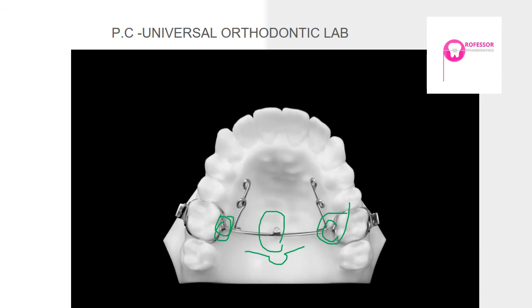One modification is a welded TPA with beautifully done soldering. In the center, a hole is incorporated to place a temporary anchorage device. Anterior soldered wires are added to engage elastics. This demonstrates TAD usage in combination with the TPA for enhanced anchorage.